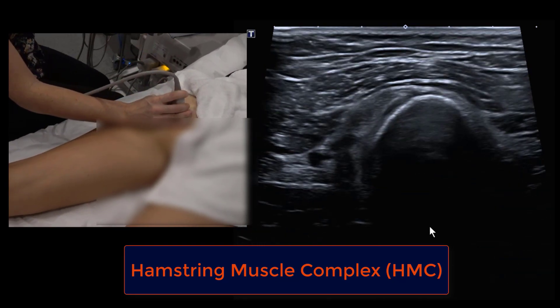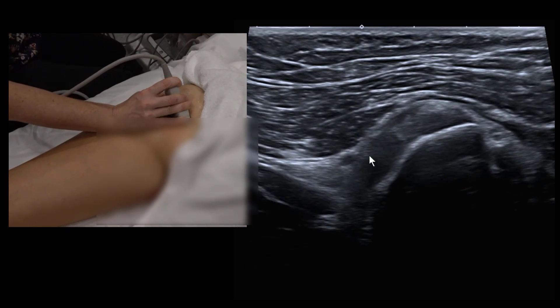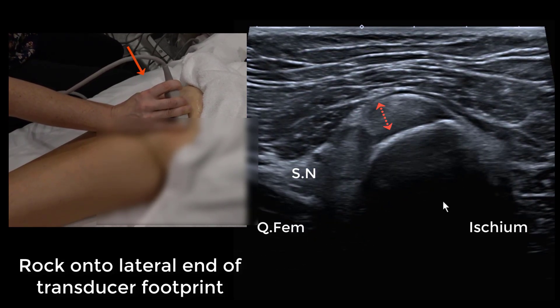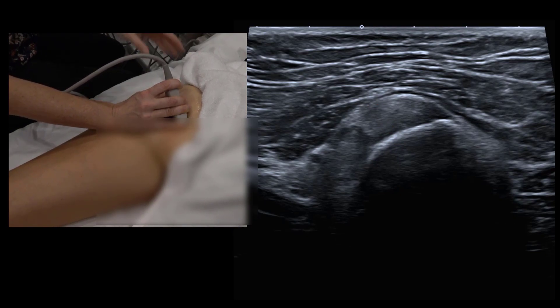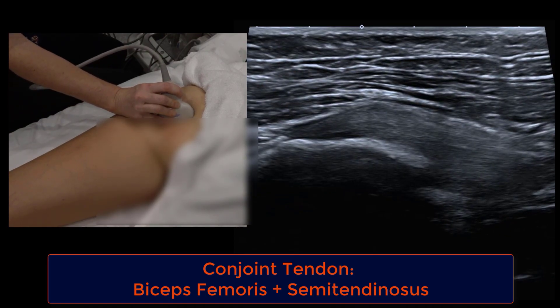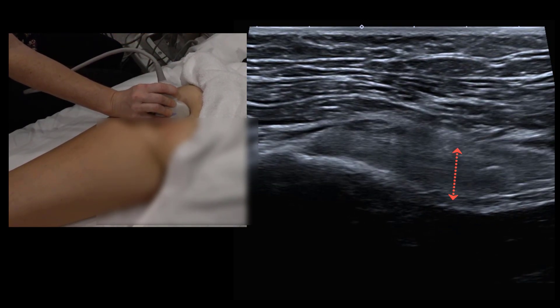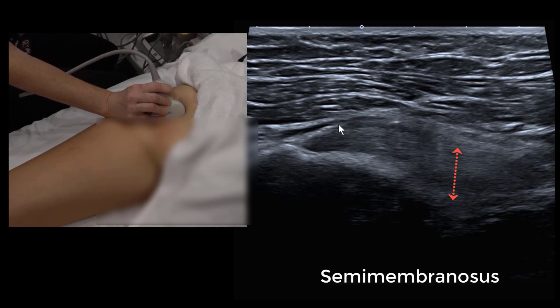In the transverse view, angle in slightly from the lateral aspect so the posterior border of the hamstring is parallel with the top of the screen — get it looking nice and echogenic and measure at this level to compare with the other side. The most posterior superficial component is the conjoint tendon, forming a nice triangle. Moving more laterally and angling slightly deeper from a lateral approach, we can see the semimembranosis.